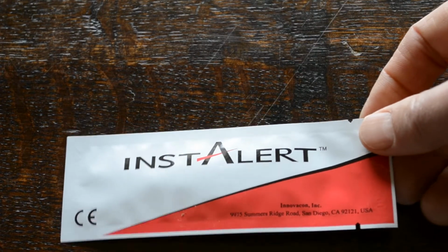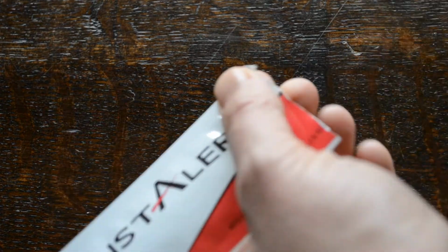Now to perform a test, this is basically a dip test into urine. If I just remove this one from the foil to demonstrate it for you. A simple perforation on the foil and the contents of the foil pouch, if we can get them to come out, are your test strip shown there, and also your pack of desiccant. Now this is just a pouch of absorbent crystals to keep any atmospheric moisture that may have crept into that foil dry and away from the test strip.